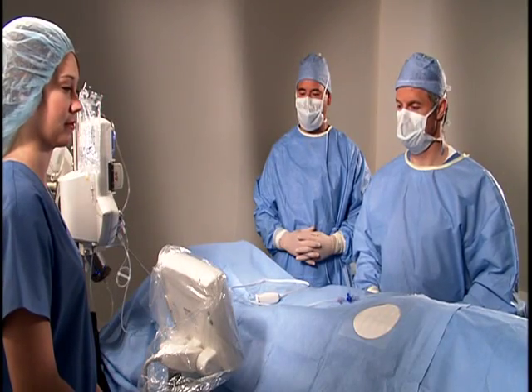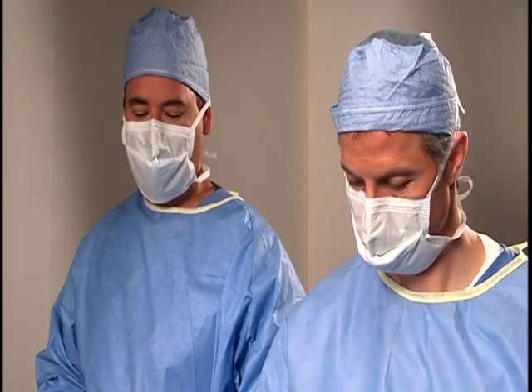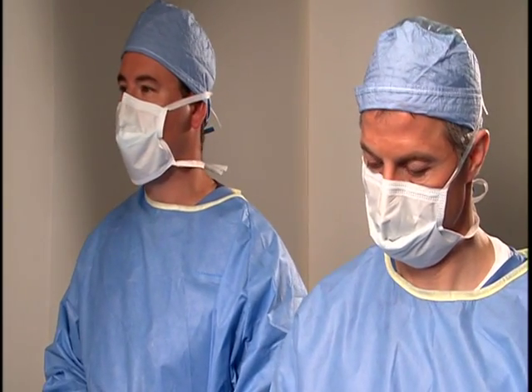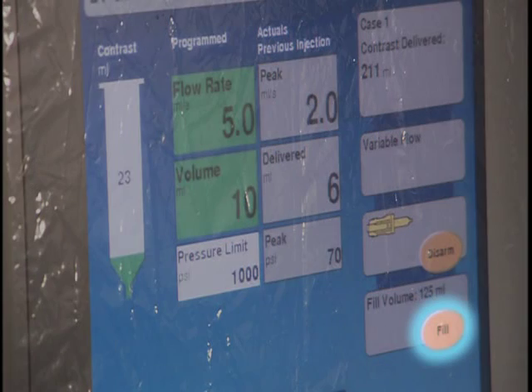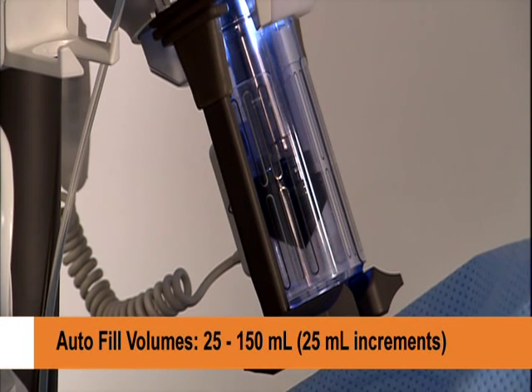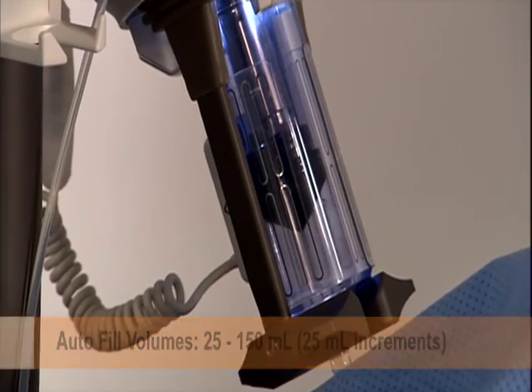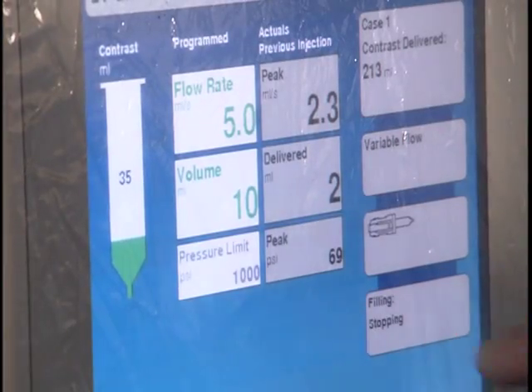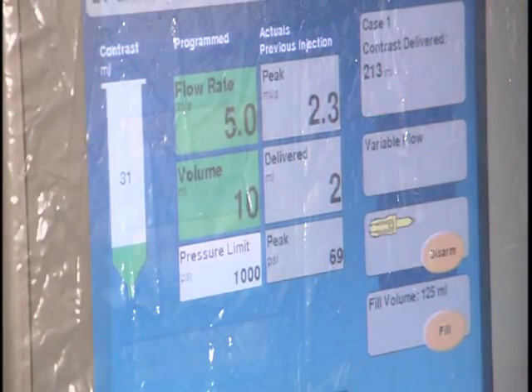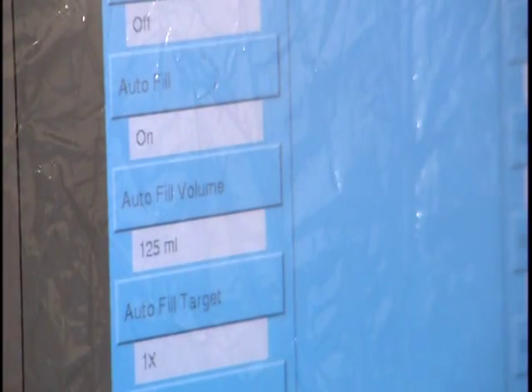A convenient feature, autofill, automatically refills contrast when there is an inadequate volume in the syringe to complete the programmed protocol. Autofill can be initiated at any time by pressing the Fill button on the main protocol screen. You can select autofill volumes from 25 to 150 milliliters in 25 milliliter increments. To stop the autofill process, simply touch the Stop button or depress the hand controller plunger. The autofill option can be turned on or off via the configuration screen.